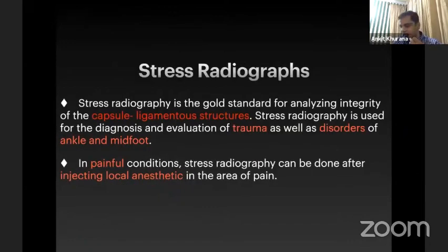Similarly, stress radiographs help in evaluating the integrity of the capsular ligamentous structures, which can be damaged in trauma as well as disorders of the ankle and midfoot. And if the condition is painful, one can even inject a local anesthetic into the damaged structure to adequately assess those structures on doing a stress radiograph.